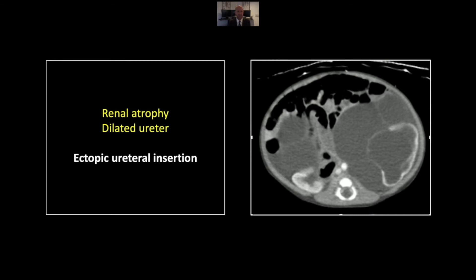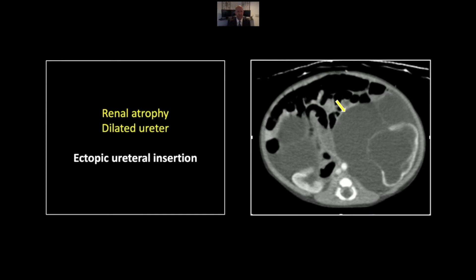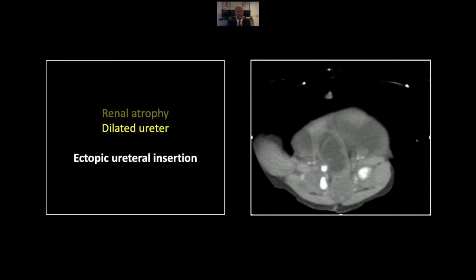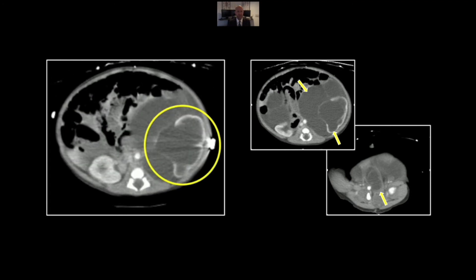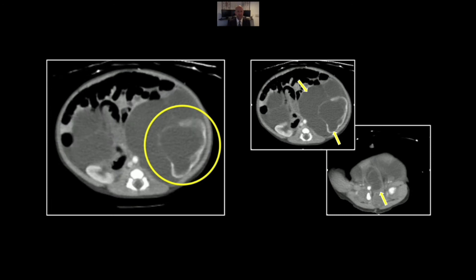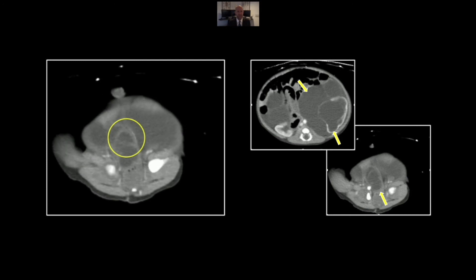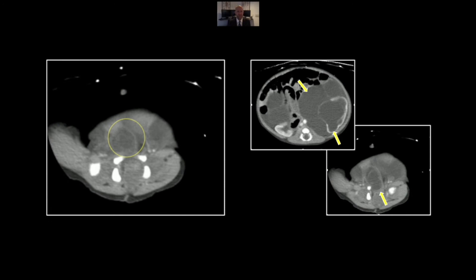Our next case is one of an ectopic ureteral insertion. This is an instructive case in that it shows just how dramatic the dilation of an obstructed ureter can become. This is an obstructed kidney with marked cortical thinning, suggesting it has gone on for a very long time. The dilated ureter is all throughout the abdomen, very tortuous and markedly expanded. The ectopic insertion is often difficult to find, but we actually see it here posteriorly, coming down in the region of the prostatic urethra. There is that chronically obstructed kidney with very little functioning cortex remaining, and there is its ectopic insertion.